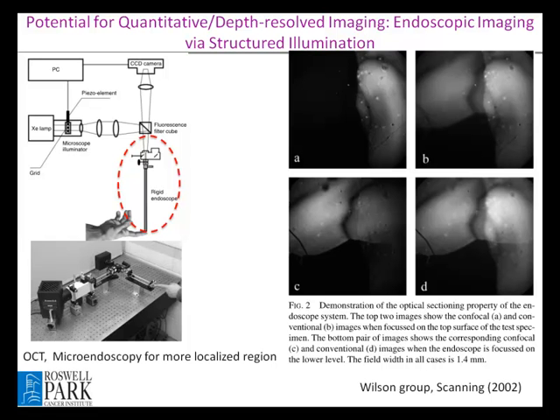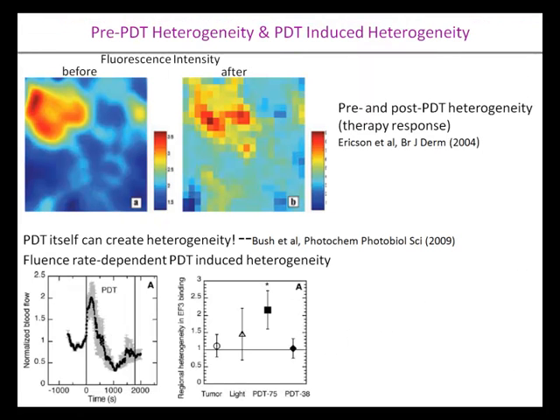So if we have the instrumentation and technical skills, maybe modulated imaging is something we can do today. Also, there are OCT people here. They can scan maybe more localized areas. That may be another option, or microendoscopy can kick in for PDT in the oral cavity related area.